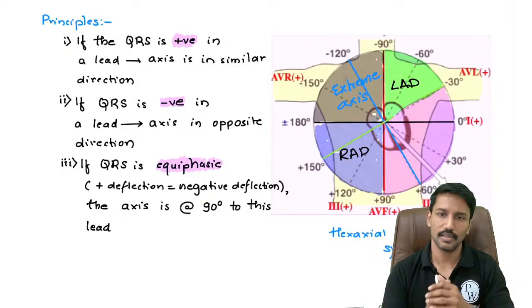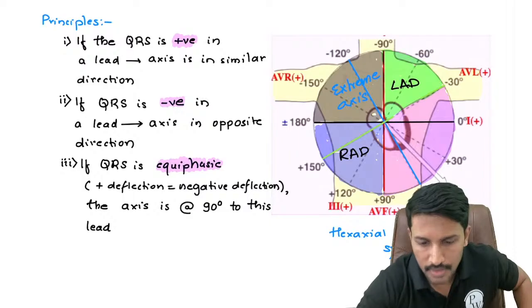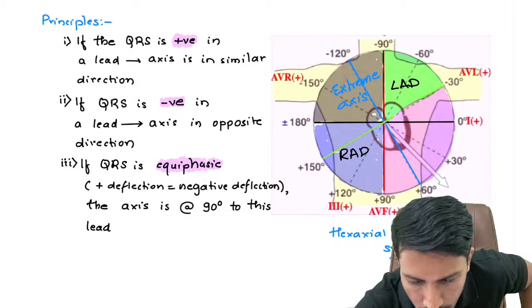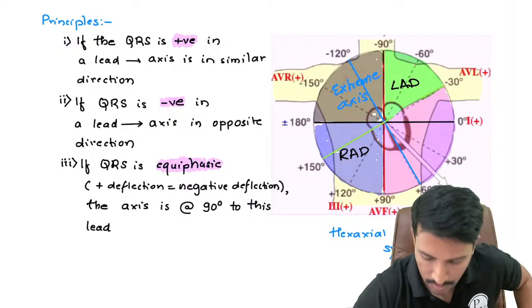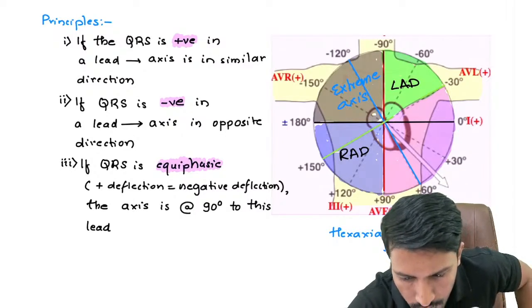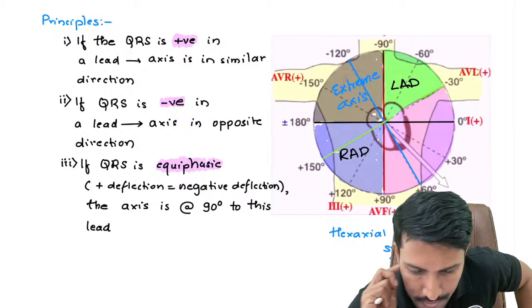How do we determine the axis? Okay. If there are any doubts related to what we have discussed so far, let me take them. Kushi, okay, I will share the answers in the PDF. Mulchand, we will definitely go ahead with that.